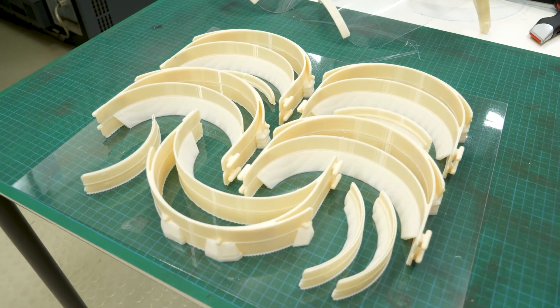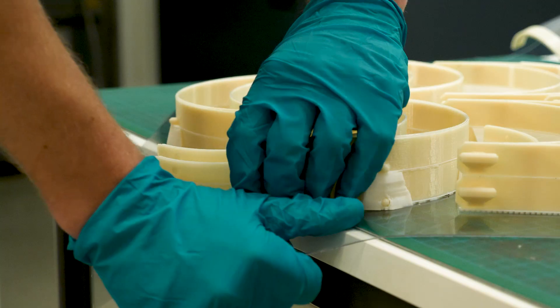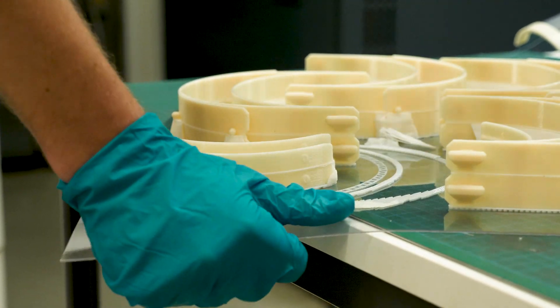To print a single visor takes about an hour and a half, but if we group them together and batch build them we can print about 22 a day. We've got the material to print 400 at the minute, but if demand keeps up we've got the capacity to do more.